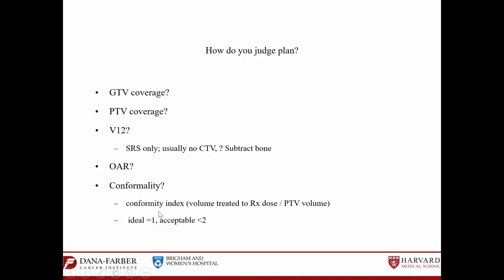There is also another index called the gradient index. That index is really assessing the steep dose falloff of your plan. So imagine you want to do a very steep dose falloff for your prescribed dose. It's going to be very hot. You will have very hot spots in there. Imagine it's like a triangle with either a high peak or a lower peak. If you want to have a very steep dose falloff, you will have very high hot spots in the middle. But if you relax your PTV steep dose falloff, you will have less hot spots in the middle. Okay.